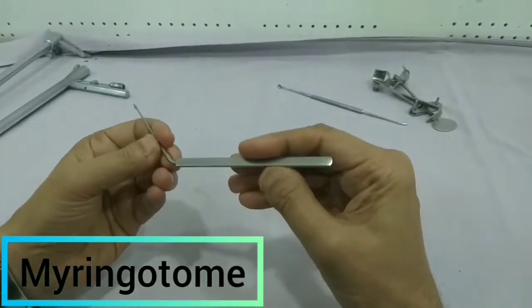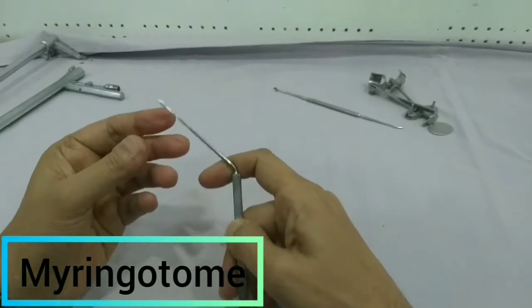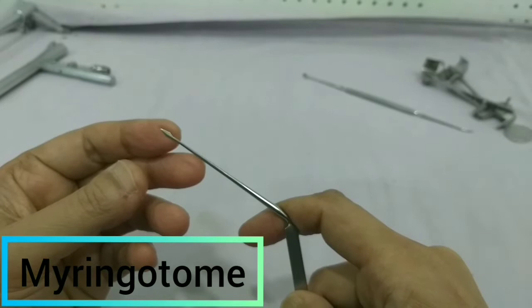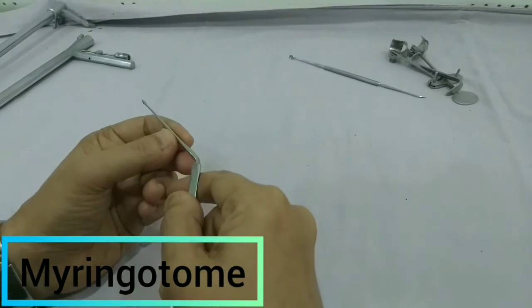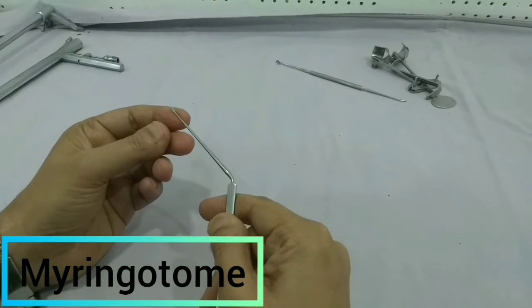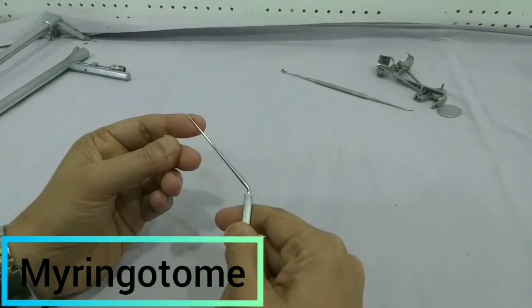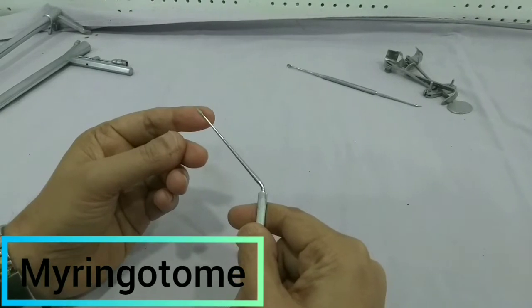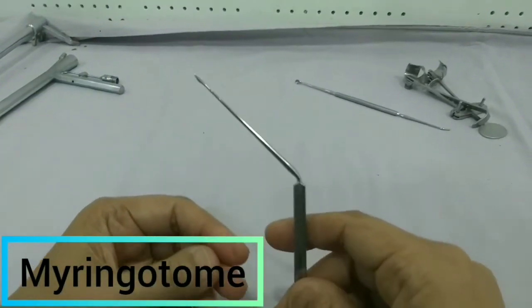This instrument is the myringotome. You can see this angled instrument — its tip is very sharp like a knife. With the help of this we perform myringotomy. This instrument is simply stabbed into the tympanic membrane to perform the myringotomy. After myringotomy we can insert a grommet if needed. Otherwise, myringotomy alone is performed in cases of acute otitis media. The grommet is inserted when needed in cases of otitis media with effusion.